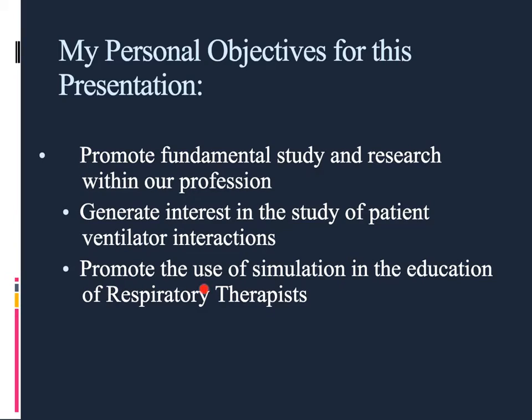I'm also an advocate of using things like the ASL5000 or lung simulators in the education of respiratory therapists, so we get a chance to actually play with these ventilators and watch and measure patient ventilator interactions. Unfortunately, that's something that many working respiratory therapists do not get to do because they're actually doing patient care.